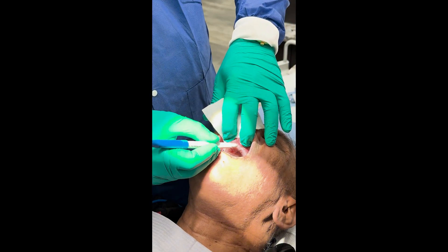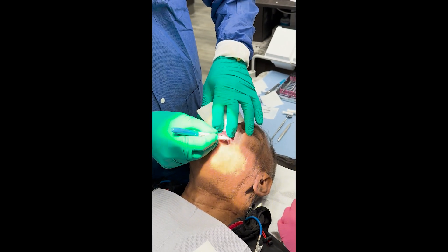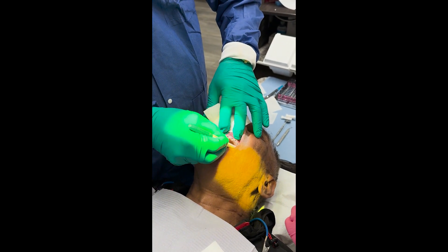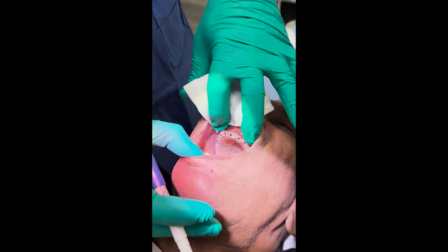One, two, three, four, five — and then we're going to do the same on the other side. One, two, three, four, five. So that's the location for the 10 mini implants.